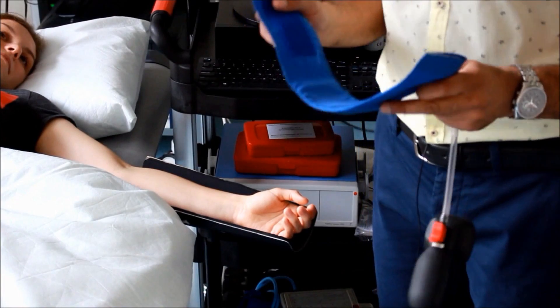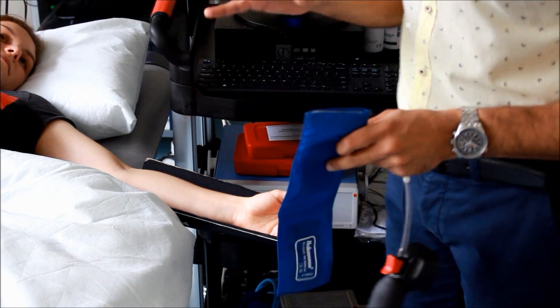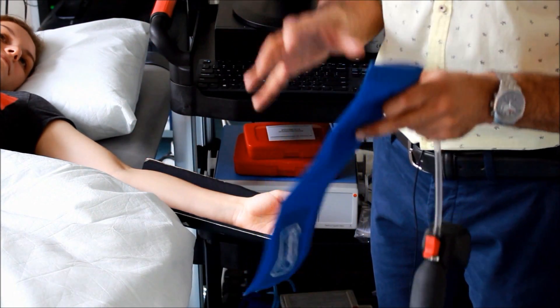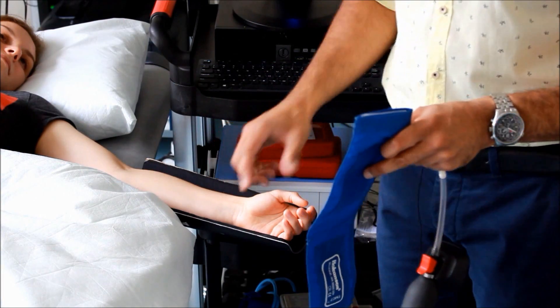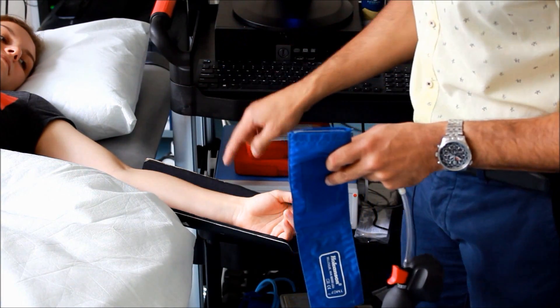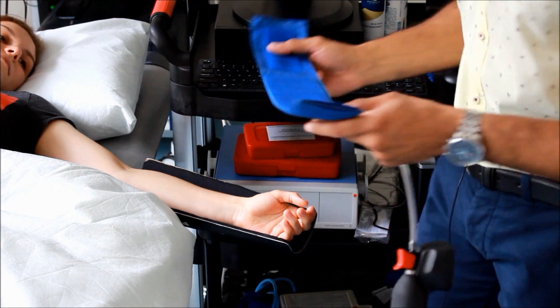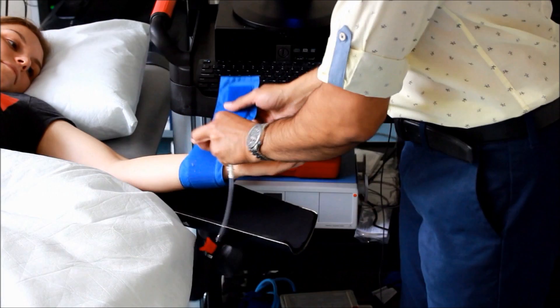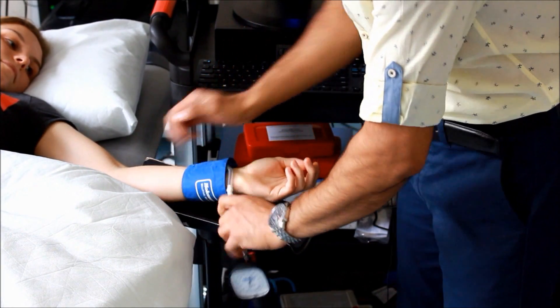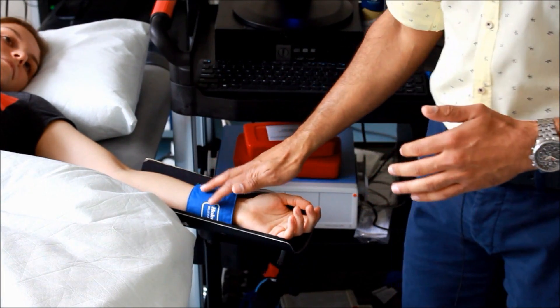The next most important thing is to put the blood pressure cuff around the wrist. Several laboratories put the cuff around the forearm, but research studies have shown that it's actually the wrist occlusion which is related to nitric oxide mediated dilation. So it's very important that we put the wrist cuff on before we actually start scanning. I'm just going to pop this on the participant's arm, just like this, and then leave it hanging across the side as we'll be using it later on.